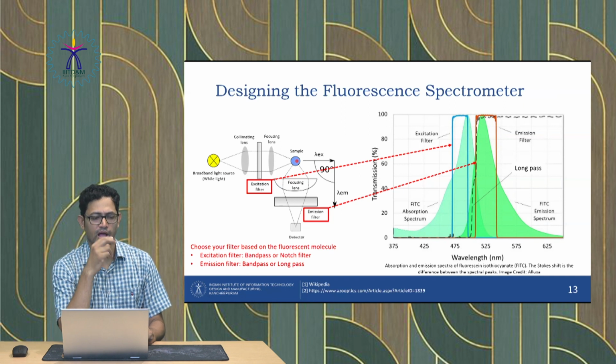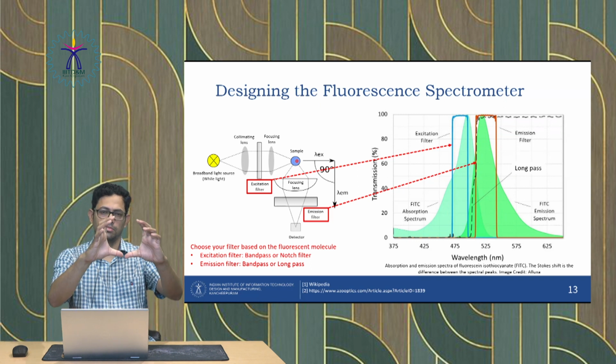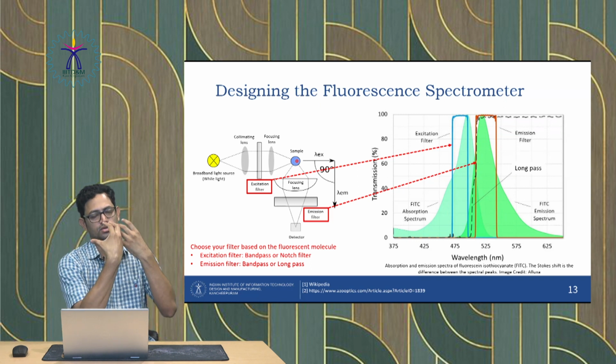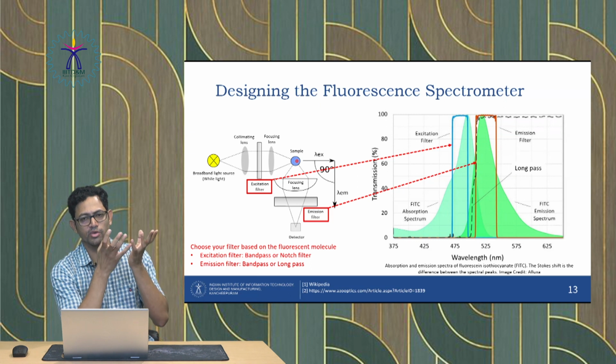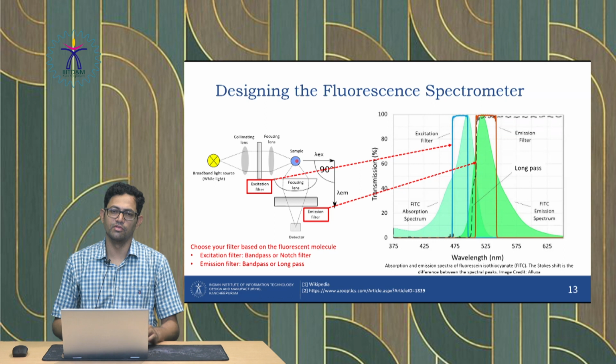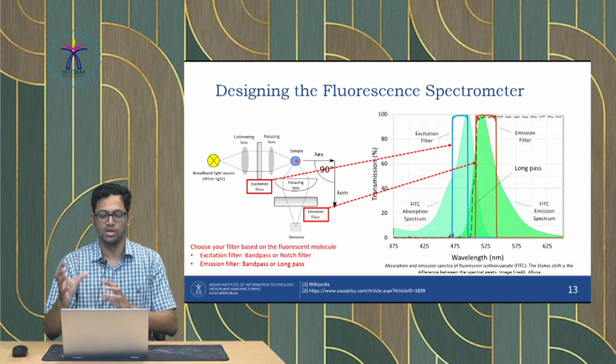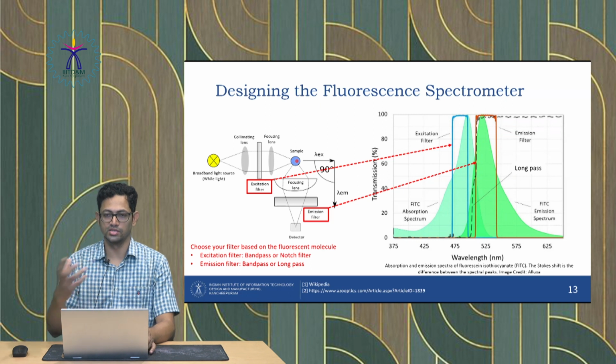We can either sprinkle the dye, or we can patch it towards the inner cavities of the oral region, and then we have a system which we can use as a fluorescence imaging probe. So in the next session we will talk about how we design such a probe, a reflection-based probe for oral cancer diagnosis.